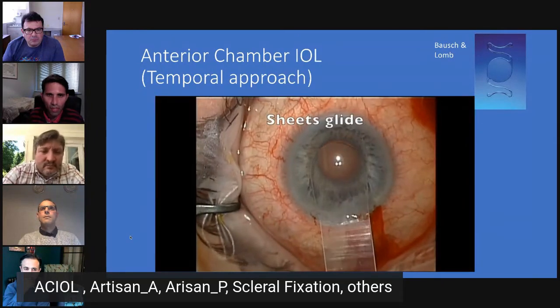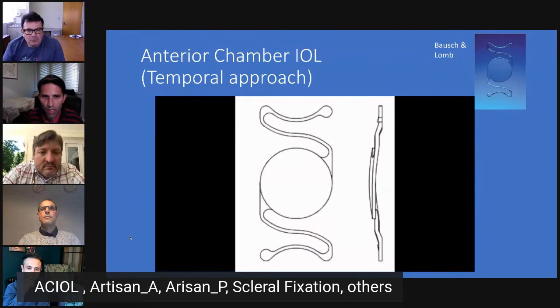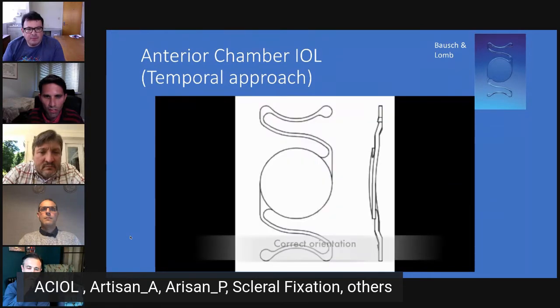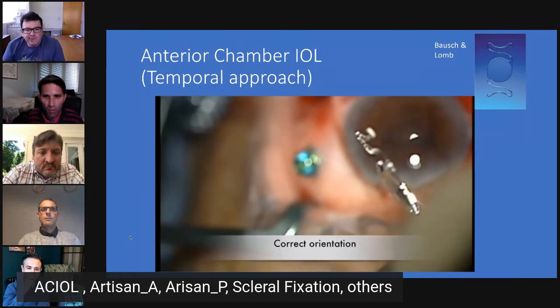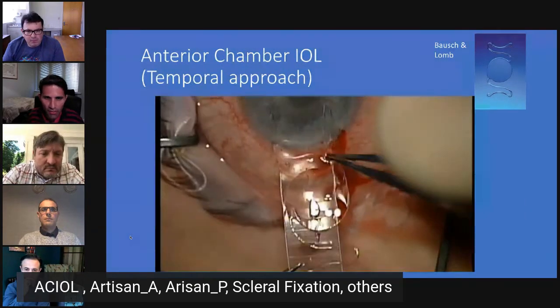And then as you described, using a Sheets glide, it gives you some idea of where to put the IOL. It's important to know which way to put it. And this is the wrong way. If you see an S, that's the wrong way to put an ACL. That's the correct orientation. And it's going to be vaulted forward like that. So that's vaulted forward. And then you see there we are. It's on the Sheets glide. But that's the correct way. That's not the S, S for stop. That's a Z for Zorro.